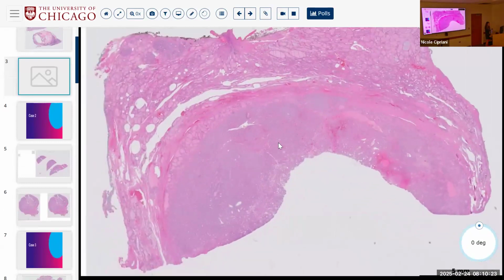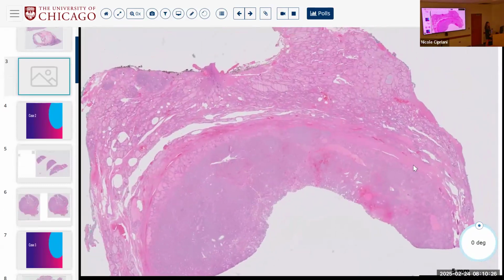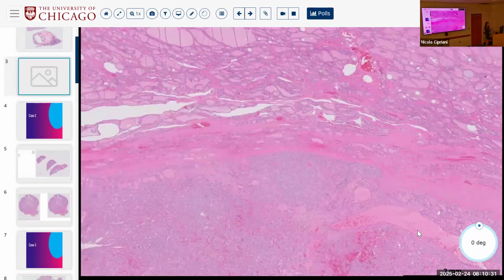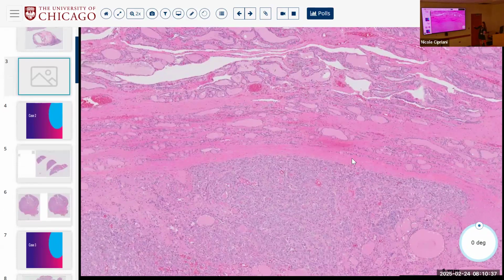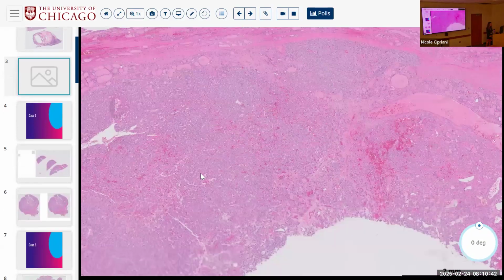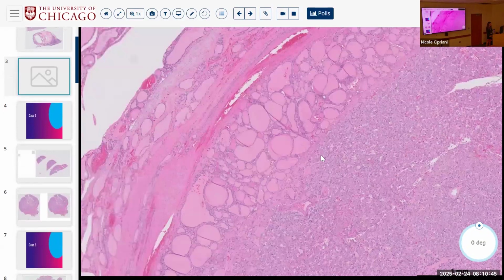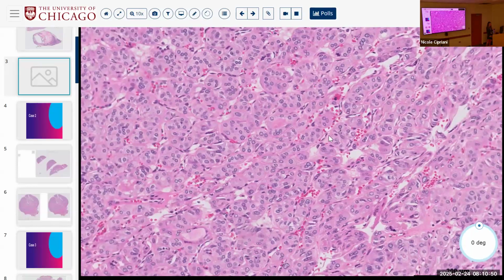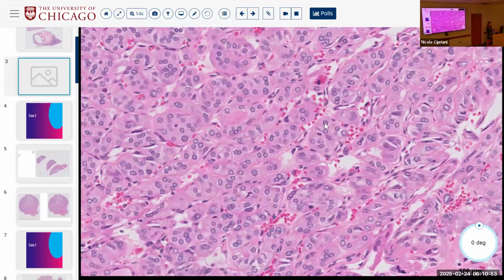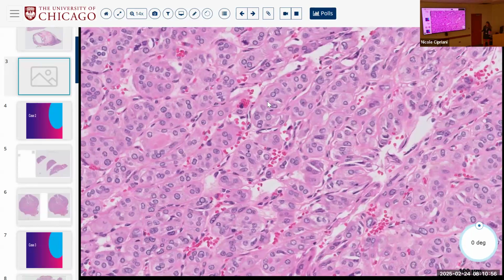The second example is really similar, and it's a different patient, but the concept is the same. It's a circumscribed lesion. There's maybe partially a capsule. There's partially a little blip into, but certainly not 100% through the capsule, right? So we can't really consider this full thickness capsular invasion. And then when we look at the morphology of the inside, you have combined both follicles and now this growth pattern. And how would you describe this growth pattern? Trabecular, exactly, right? So they're sort of elongated. They don't have colloid in the middle, and there are these elongated things called trabeculae.